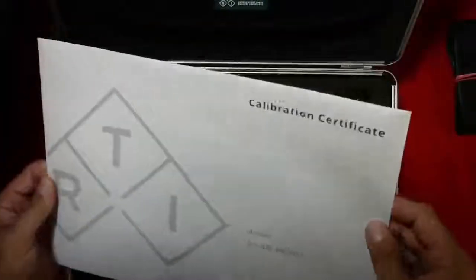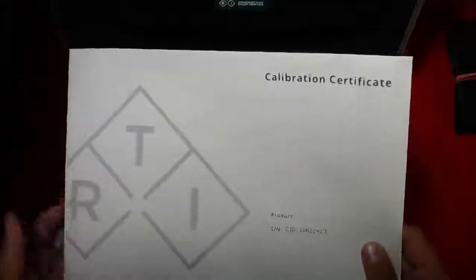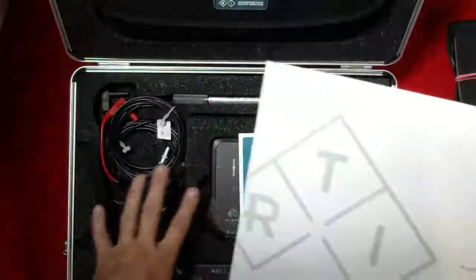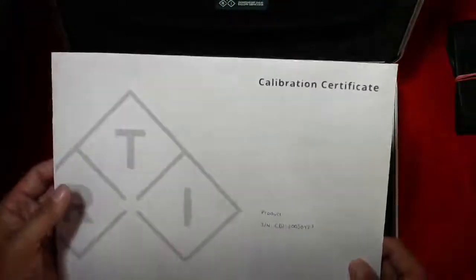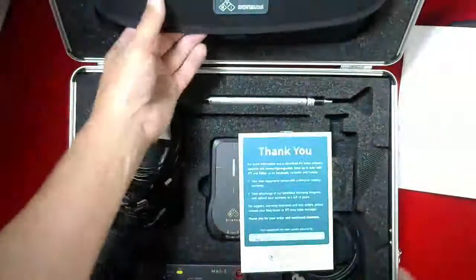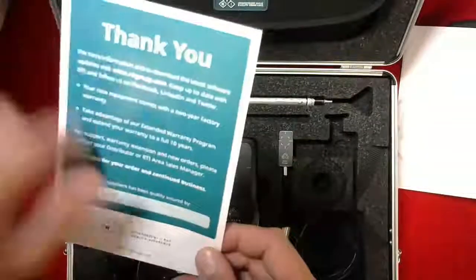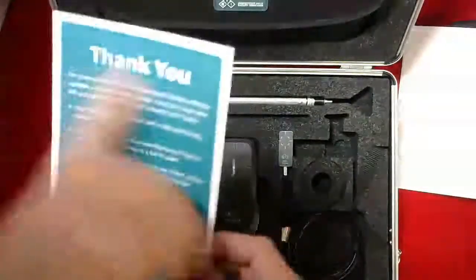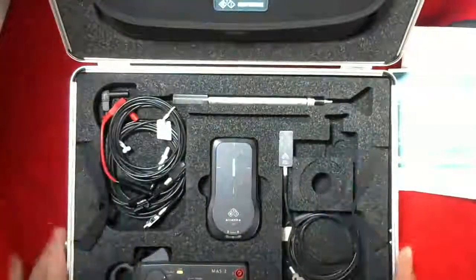First thing is the calibration certificate. This meter comes with a two-year calibration and hardware warranty. You can also extend this warranty for an additional two years every time you have it calibrated for an extra 20% of the calibration cost. And a nice thank you note that gives you more details about where to find information on your product.